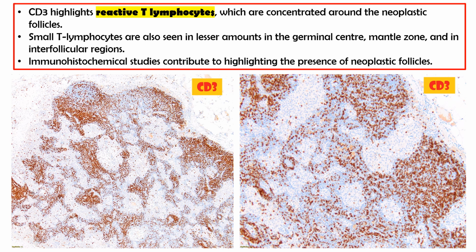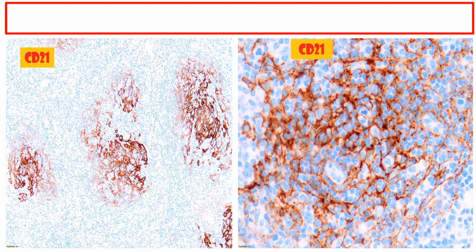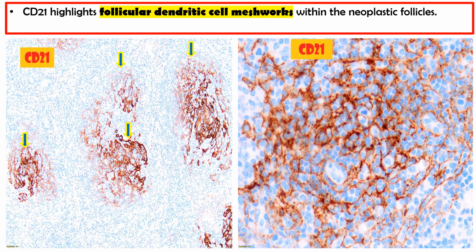Immunohistochemical studies contribute to highlighting the presence of neoplastic follicles. CD21 highlights follicular dendritic cell meshworks within the neoplastic follicles.